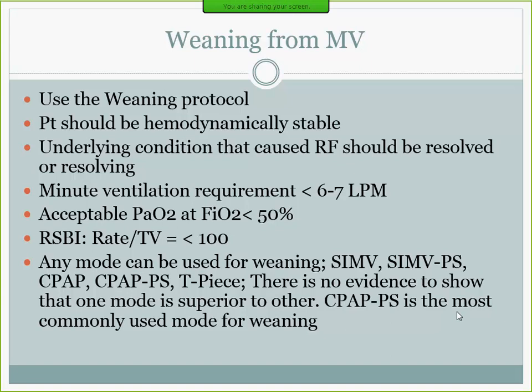Every day we should wake up the patient and let them breathe on their own. So that's what it is, right? And then we have a weaning protocol in place. The advantage of the weaning protocol is the therapist will look at all these parameters, will change your mechanical ventilation mode, and you don't need an order for every FiO2 and respiratory rate change.